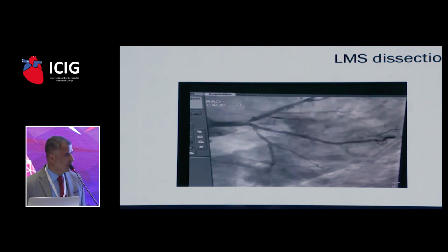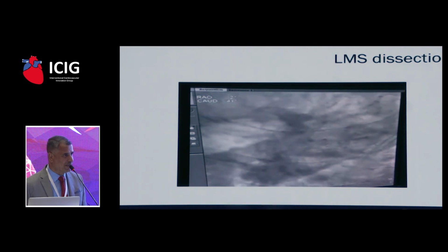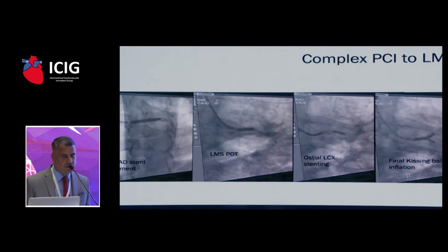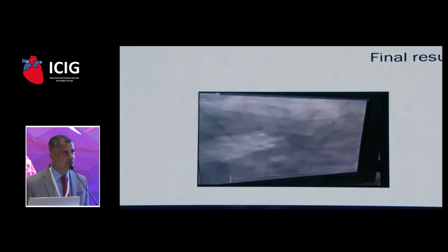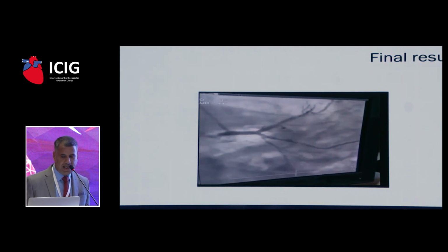And that was the angio. What do you see? So it was, yes, very good. Guide related left main stem dissection, and we did the proper procedure, ballooning, kissing balloon, put this. Everything was done through the distal radial approach, and that was the final result. So you can deal with perforation, complication, main stem intervention, and other imaging, and so on.